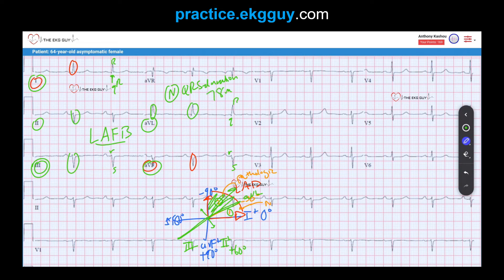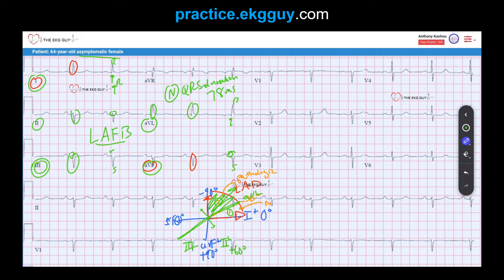The QRS duration was 78 milliseconds — within normal limits. We also need to exclude other causes of left axis deviation, namely inferior MI. We don't see evidence of inferior MI; clear R waves are present in the inferior leads. The patient is an asymptomatic female, so clinical context is important. Left ventricular hypertrophy and left bundle branch block are not seen here. A known underlying lung disease or ostium primum ASD is also unlikely given only the information of a 64-year-old asymptomatic female. So we give the diagnosis of left anterior fascicular block.